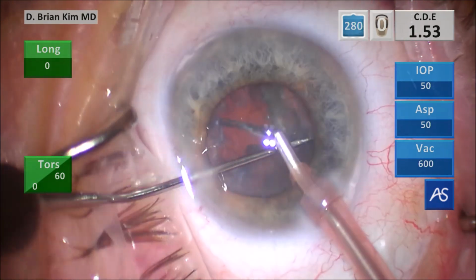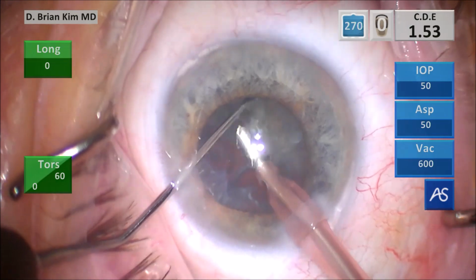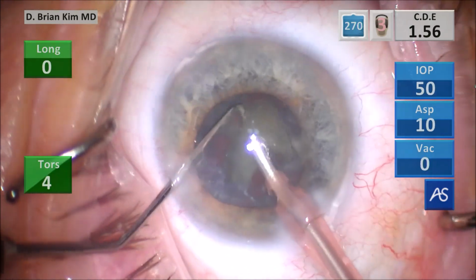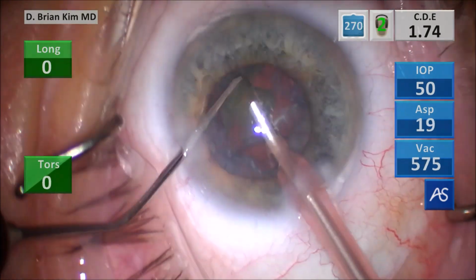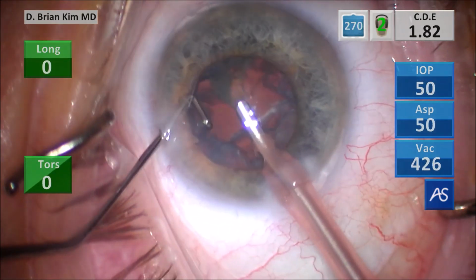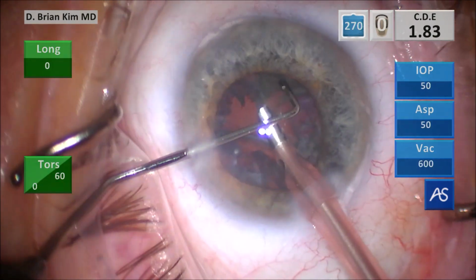So this is quadrant number 4, placing the chopper around the lens piece, pulling it centrally toward the phaco tip, and I'm able to crush the lens piece. Again, I'm dividing the lens piece using mechanical forces without having to use vacuum during those maneuvers, which is good because if I go near the pupil with high vacuum, I might grab the pupil.